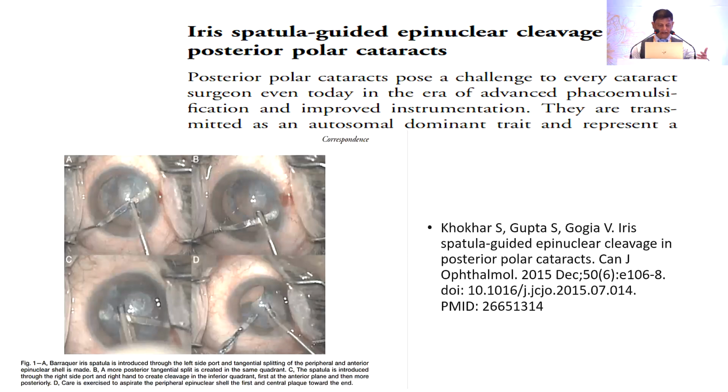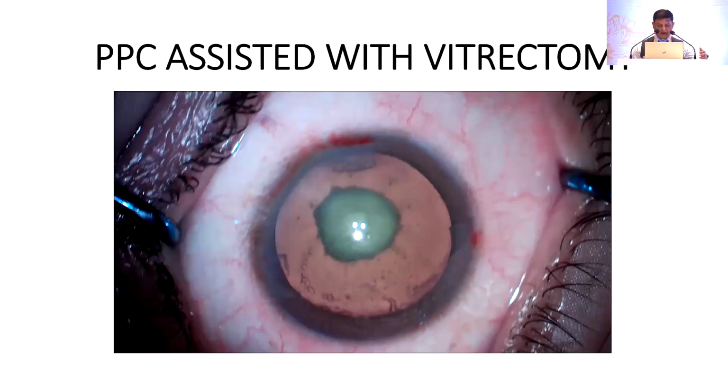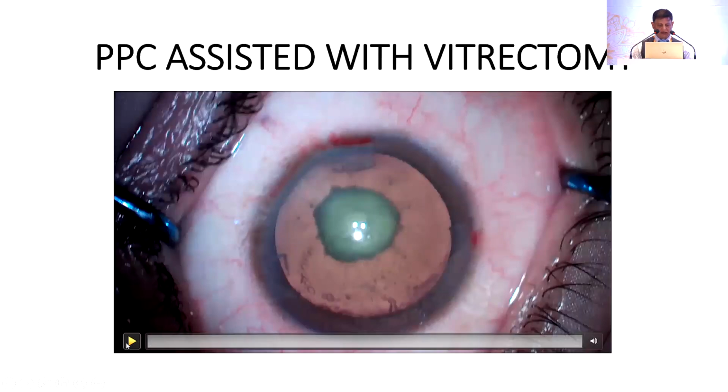These are the principles of managing these cases. In one of the papers published, iris spatula guided epinuclear cleavage in posterior polar cataract was done, because that avoids rotation. So here is a video presentation of that.